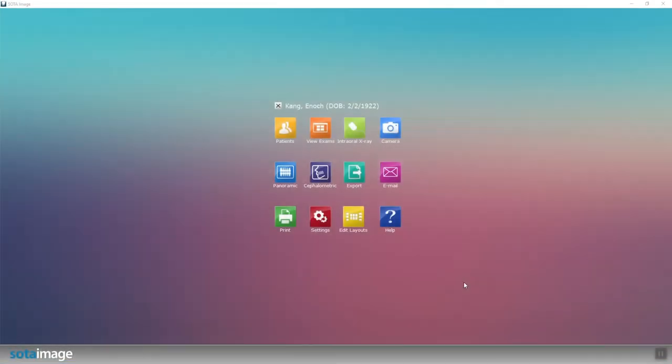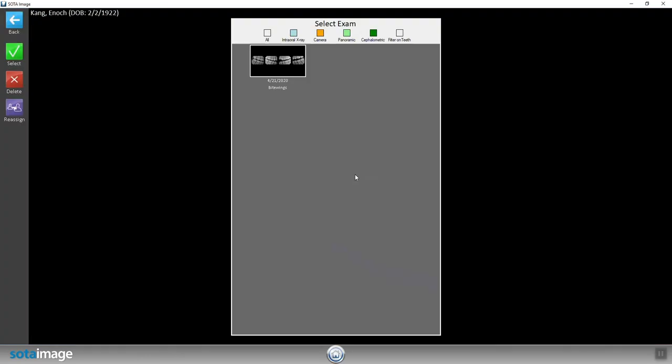In this video, we'll be covering a few ways to export images. With the correct patient bridged, hit the teal export button in the middle. Double click the exam you wish to export.